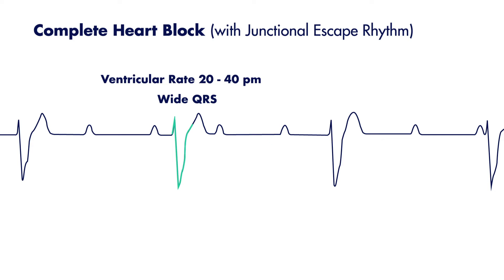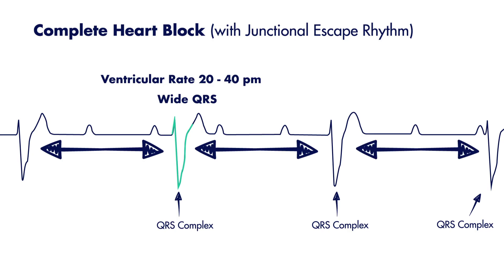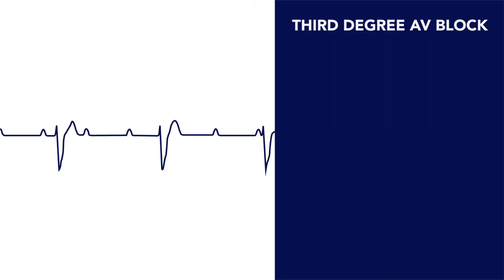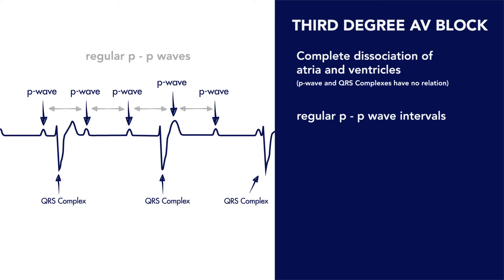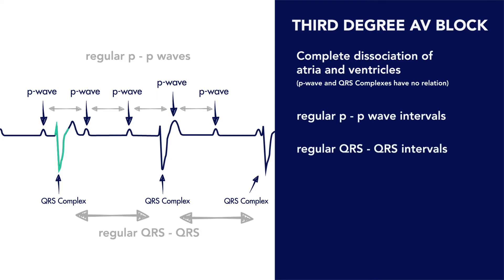Regardless of whether or not the ventricles are conducting through a junctional or ventricular focus, like the P waves mentioned earlier, you can also march out QRS complexes at regular intervals through your cardiac strip. So in summary, with complete heart blocks you'll see a complete dissociation with electrical activity from the atria and ventricles. Although P waves occur at regular intervals and QRS complexes also occur at regular intervals, they do so independently of one another, and so there is no association to when a P wave is followed by a QRS complex.